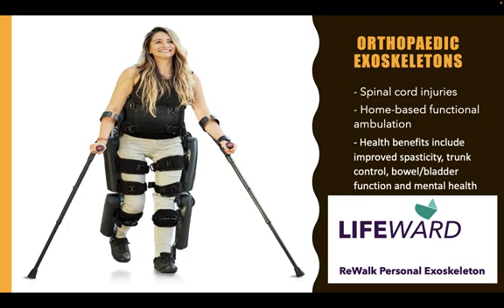You could be measuring step count, cadence, stride, walking speed and velocity, tibial shock on joint loading to predict the longevity and the lifespan of your implants, to figure out the wear patterns as well, and the need for revision surgery, as well as recovery kinetics post-operatively after an arthroplasty, with clinical and patient-related outcome measures.